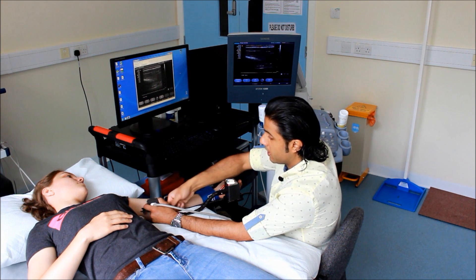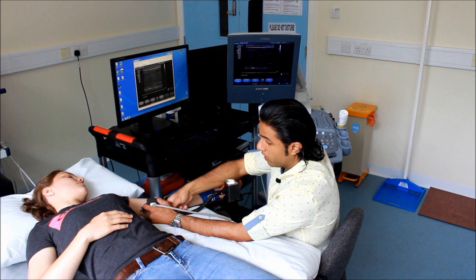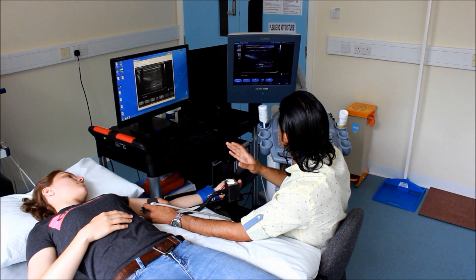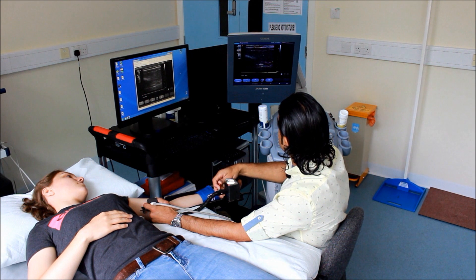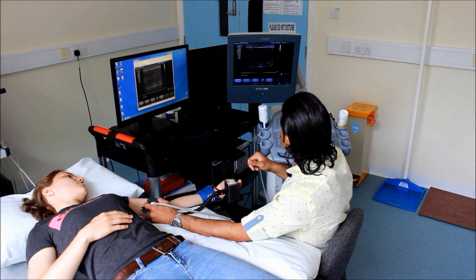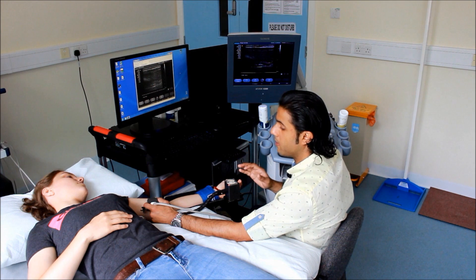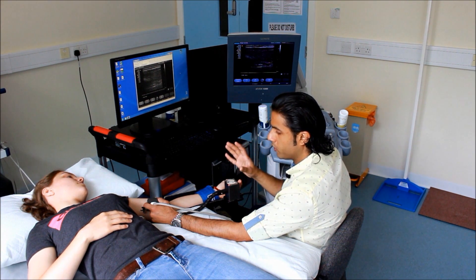Once you've got a good quality image, the next thing to do is tighten the clamp holder whilst trying to maintain the image. You've got to have a very steady hand for this. Depending on what clamp you use, you've then got to lock that clamp into place. Once you've done that, you should hopefully have a nice good quality image in which to record the baseline diameters.